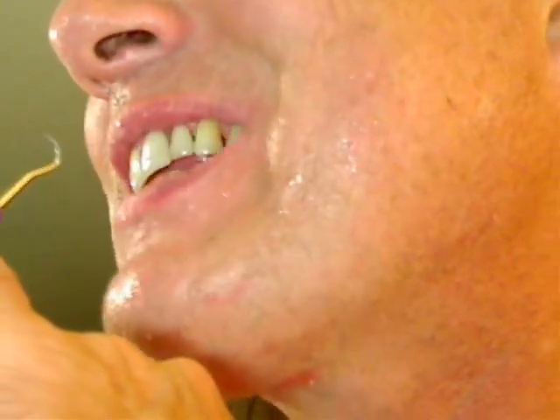Large volume, gigantic blobs. Every one of these blobs that comes out is something that's not there anymore. Going in there, right up against the bone, and there's calculus that's butted up against there, and it's probably from the abscess. The abscess probably pushed in and pushed the bone in — that's probably what happened.